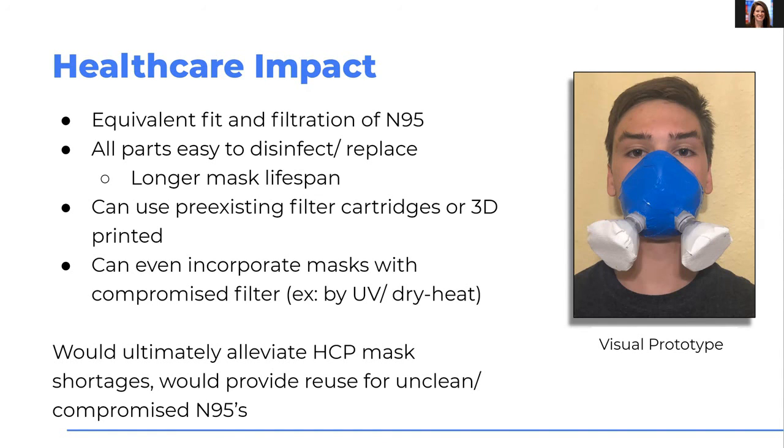So we can really use any seal. If there's a different tape that doesn't have that same glue, we could use it. Anything that's non-breathable, any non-breathable material, as long as you cover up the old filter, it should be fine.